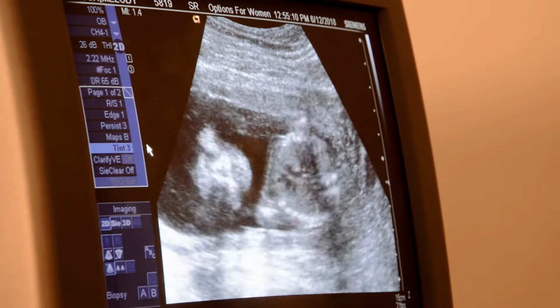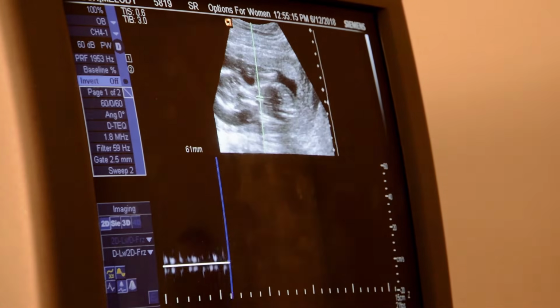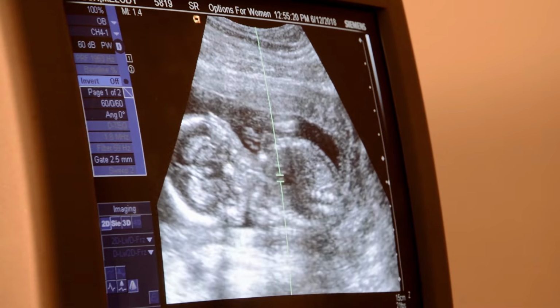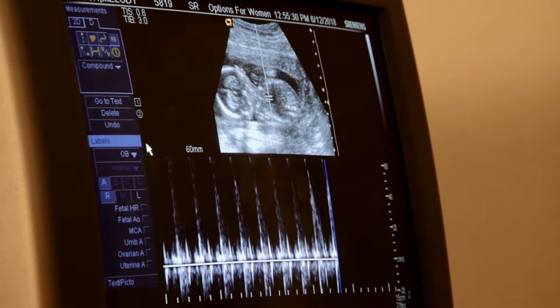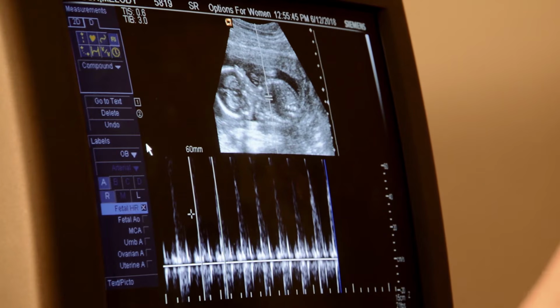You want to hear the heartbeat, Mom? Yeah. Okay. Oh, he's moving here. Let's see. Let's put that cursor right. Oh, that's a good beat. Let's see what you got here. We are 136 beats. So that's good. Take that.